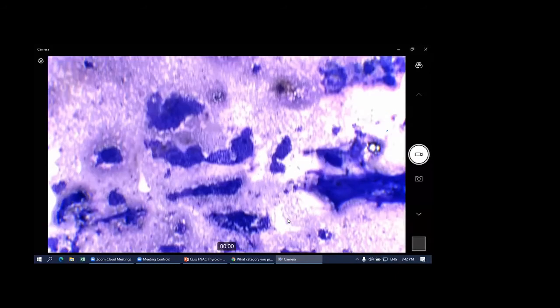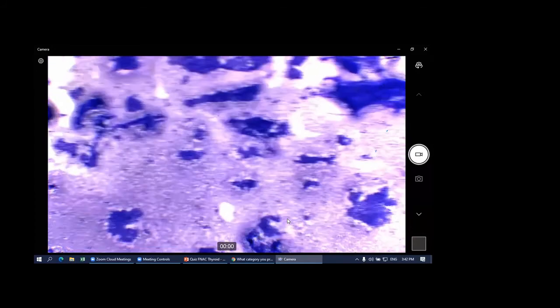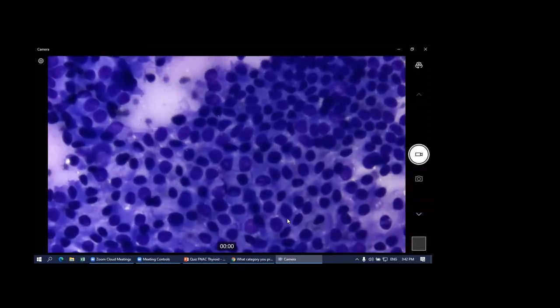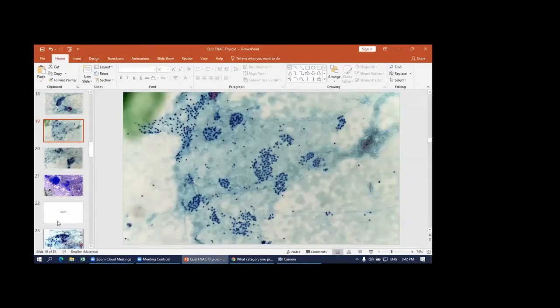The MGG is actually a lot more cellular than this. Even though it is actually not that advisable to look into the nuclear feature in MGG, sometimes beggars can't be choosers, right? But we need to have a look at it. Can you see the nuclear feature? Yes. All right.